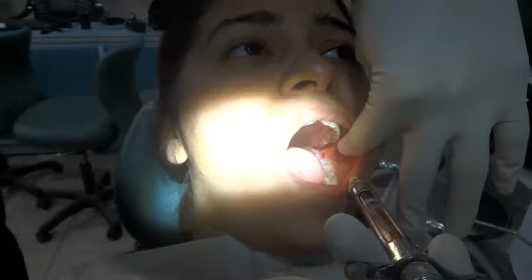Now long buccal anesthesia is being injected.